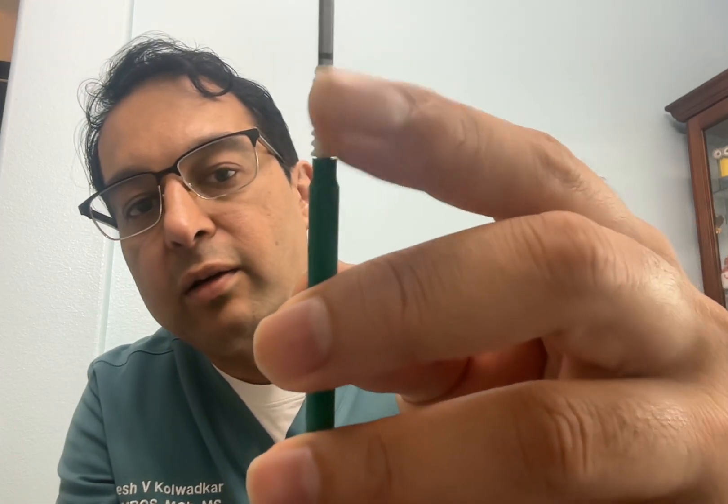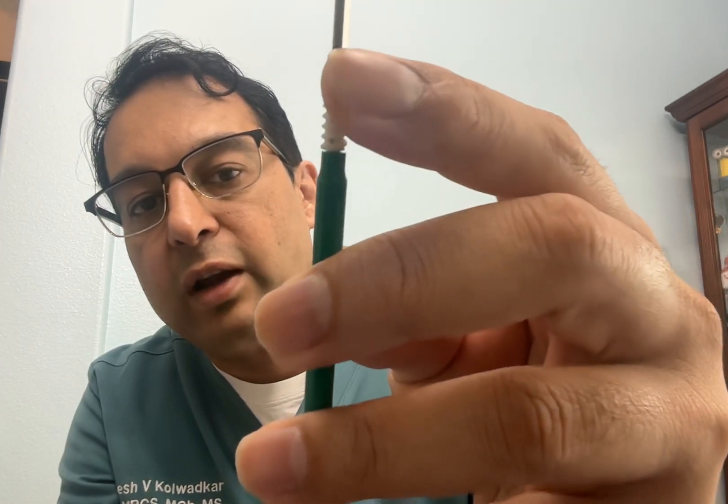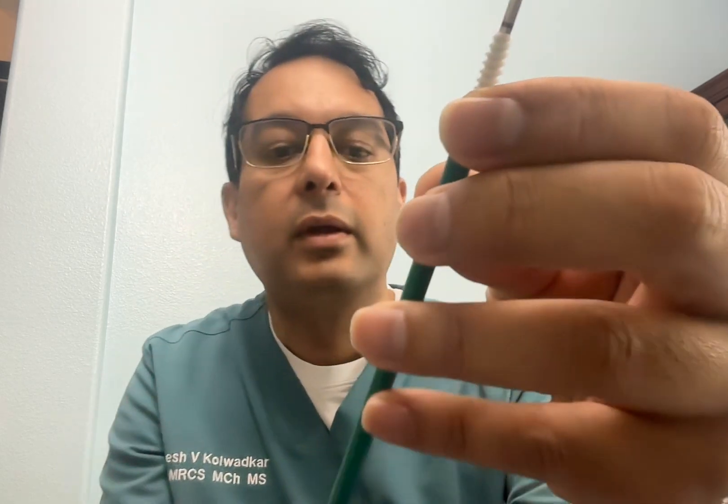The anchor has vents which allow bone marrow to come out and help in the healing process. It provides very secure fixation. It comes in three, sometimes four sizes — this one is 4.5 millimeters in diameter and approximately 19 millimeters in length.